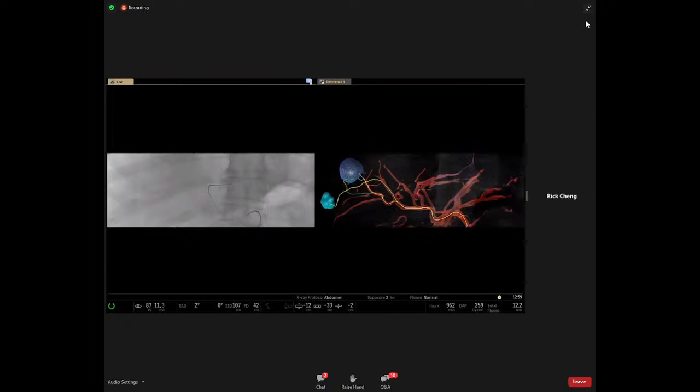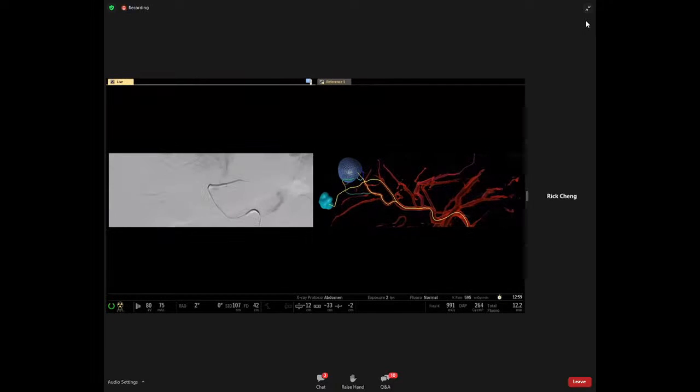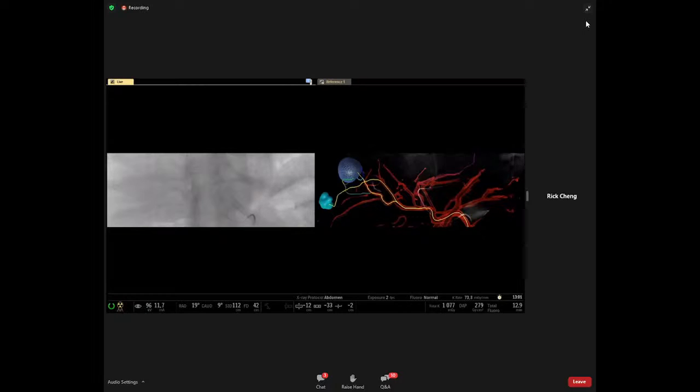An acquisition is made to check if the catheter is in the correct position for the next embolization. To prevent reflux, the catheter is further advanced into the feeding artery. This means that all administered embolization material will flow to the tumor tissue and not to the healthy tissue. After the procedure, the results of the embolization can be checked by performing a cone beam CT scan to see if all the feeding vessels are blocked.